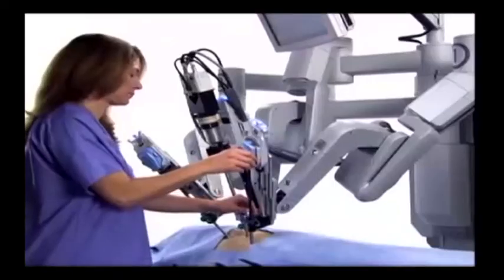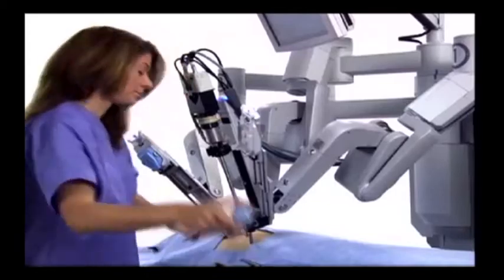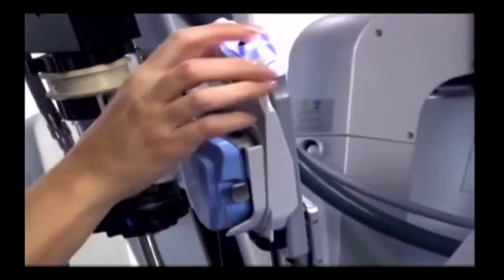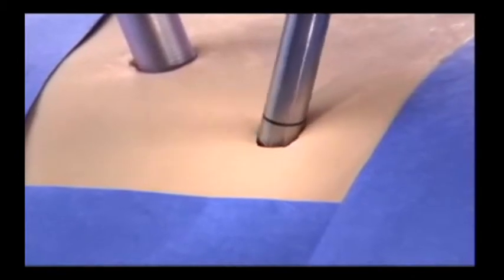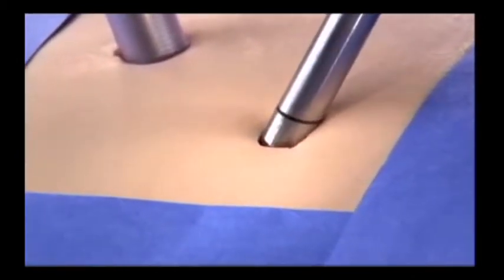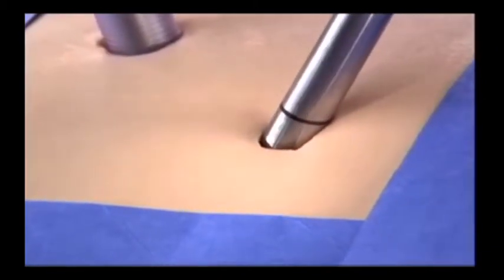All right, so you deal with tremors. Then the other benefit that the patient would get is the size of the incision on the patient. Oh yes, absolutely. From an open prostatectomy to robotic, there's a lot of difference. The incision in open prostatectomy is from the umbilicus down to the pubis. It's a big incision to take out a small prostate. With laparoscopic and robotic, the skin incision is only half an inch, but at 3-4 places. Eventually, these will mix up with the skin, and it won't be seen at all. So that's one big advantage with the robotic as well.